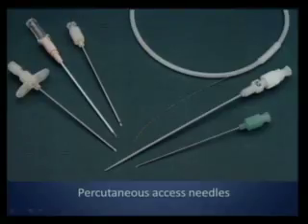These are the percutaneous access needle sets you need to know about. Does anybody know what needle this is? This is actually the old Seldinger needle. You have a trocar inside it and an outer cannula. This is a double wall needle wherein, when you do a femoral puncture, you would not worry about going through the posterior wall. You would go all the way to the bone, turn the hub around, take the stylet out, and then slowly pull back till you get into the artery.